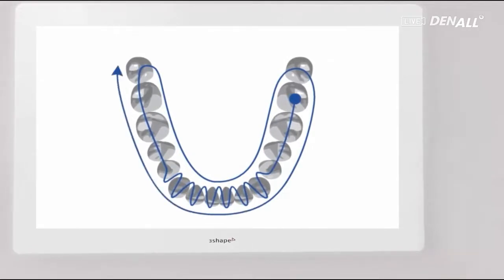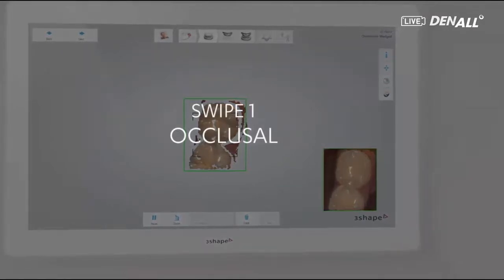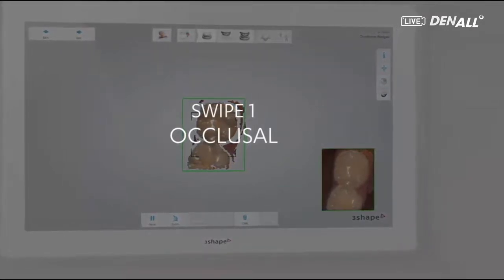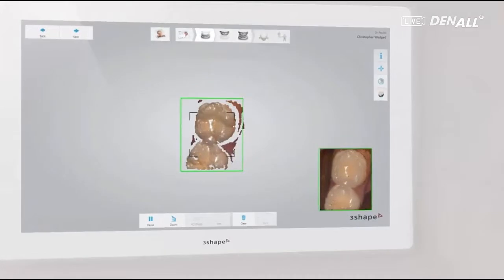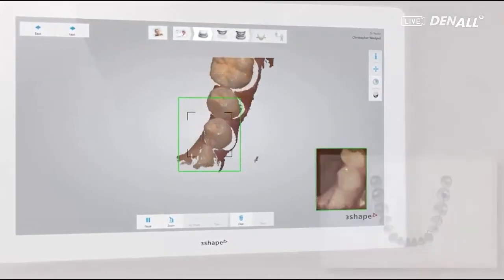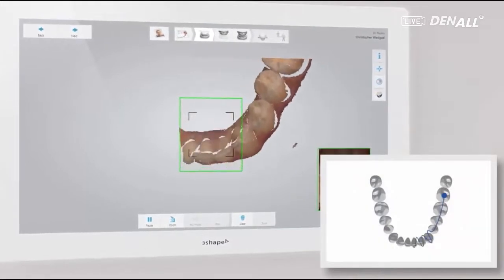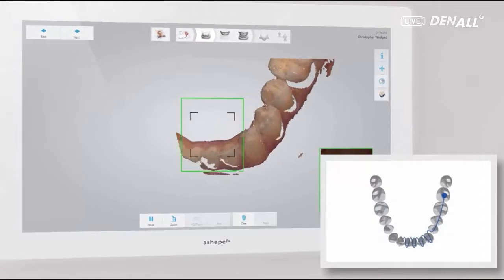So there are a lot of distortions in the data in the case of a full mouth. A one-body type prosthesis for the full mouth may have lower precision in terms of fitting.